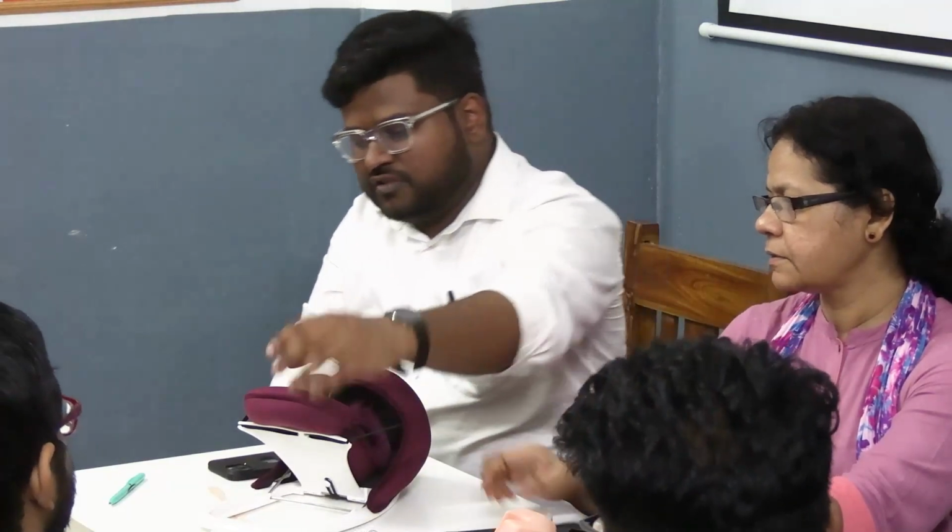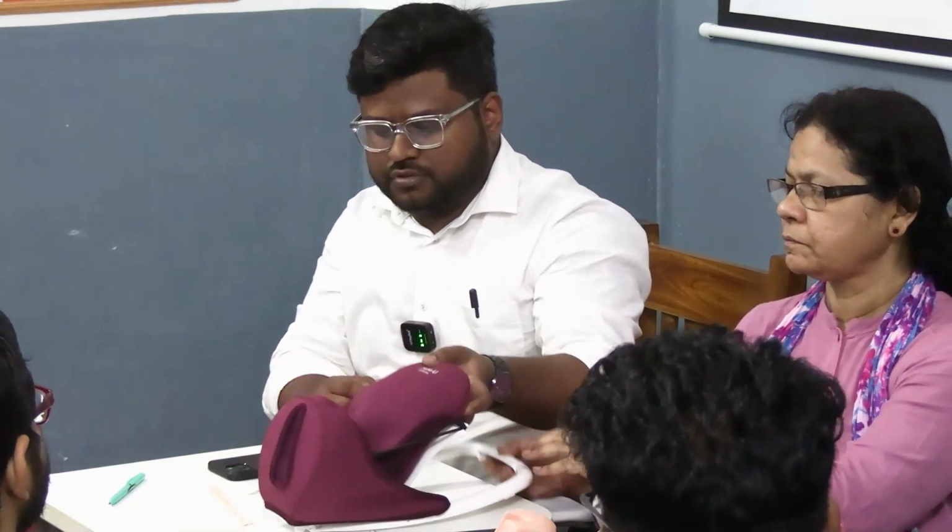PPIUCD, postpartum intrauterine contraceptive device. See, this is a postpartum uterus, a large uterus. We've moved on to the next topic, but keep the catheter. Okay, this is your postpartum uterus just after delivery, a large uterus. What do we do? How do we insert a postpartum copper T or IUCD?